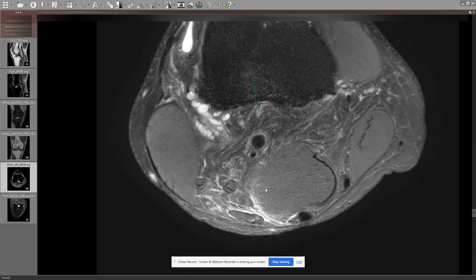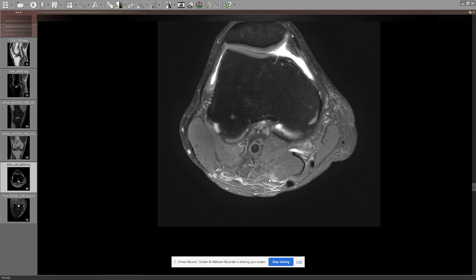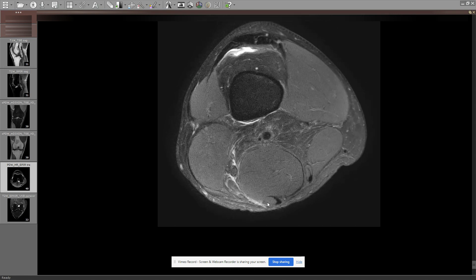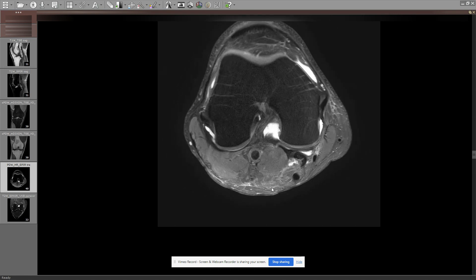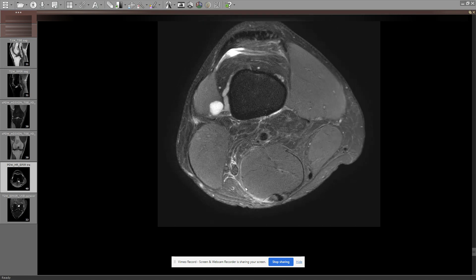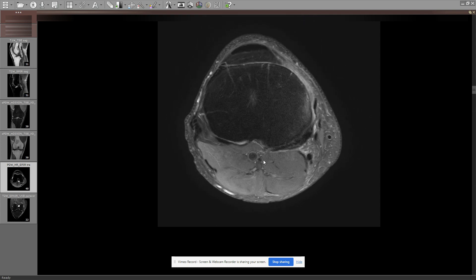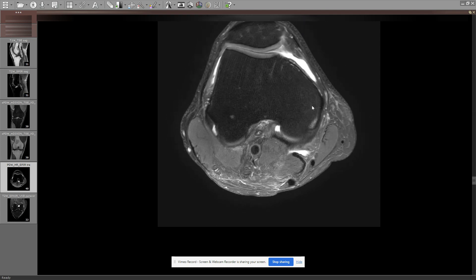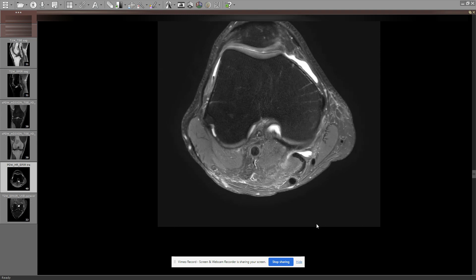Then tendons — we can also check the muscles. You can see there's a bit of edema along the semimembranosus fascia here with a bit of edema. But that's really it. At this point I would have everything and I would be happy.